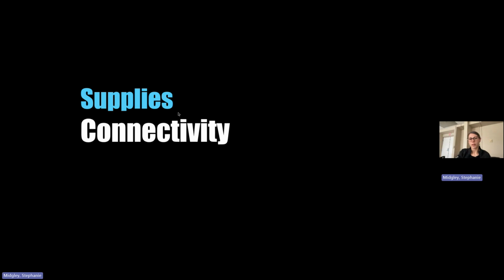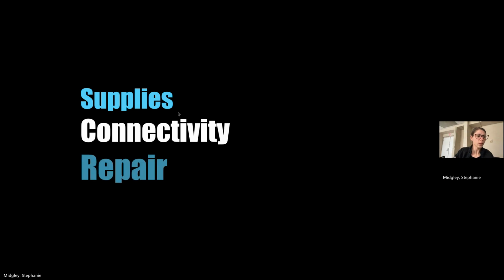You talked a bit about the connectivity. So knowing who your Biomed folks are, because they're the ones who are going to get you on the Wi-Fi, and they're going to do the actual physical repair of the machines. And then knowing the rep, who to contact from the company to come in and do the software updates and any other troubleshooting for you.